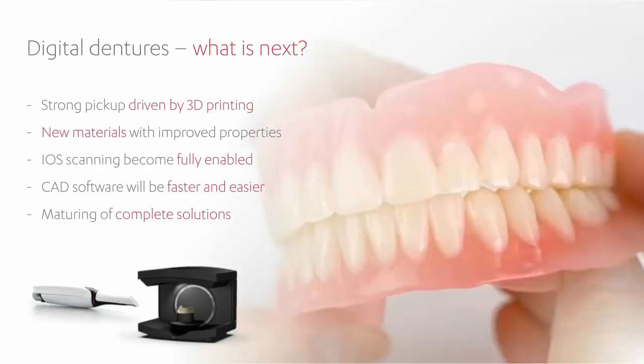Looking at digital dentures, what is next? We really believe we will see a very strong pickup. We see it's already exploding, and more so since the IDDS in Atlanta. We see new materials coming, and a strong pickup driven by 3D printing. We will see IOS scanning becoming fully enabled with workflows. It's actually very enabled already.